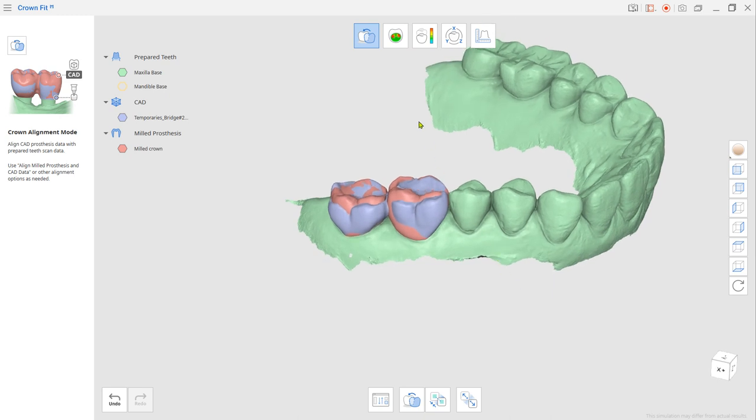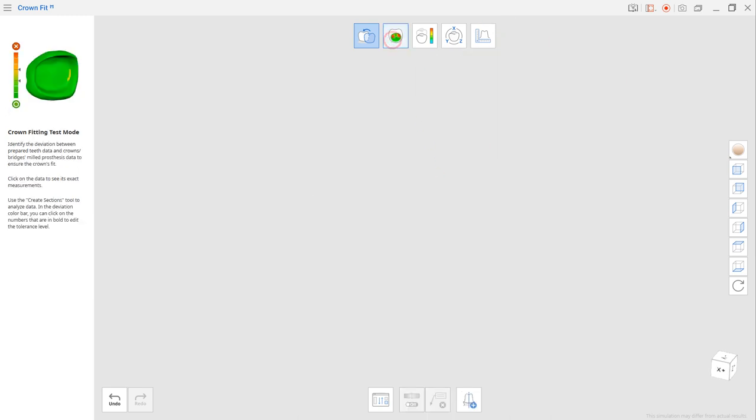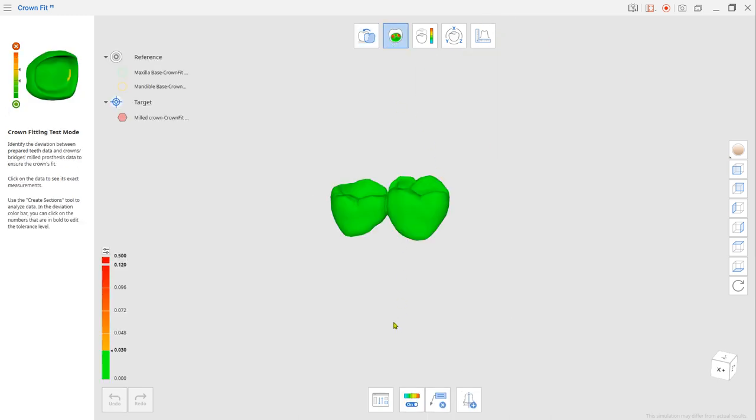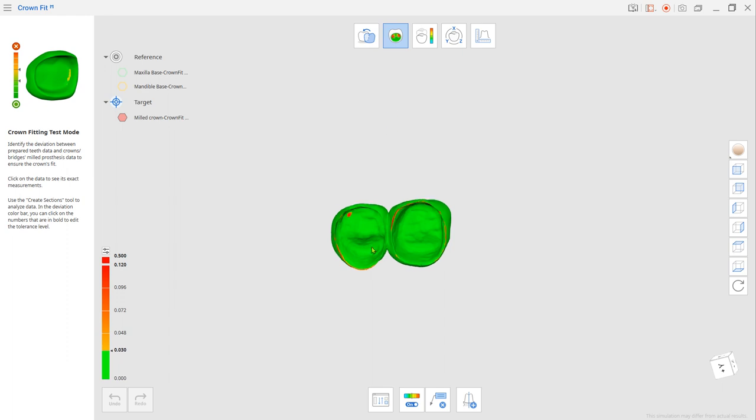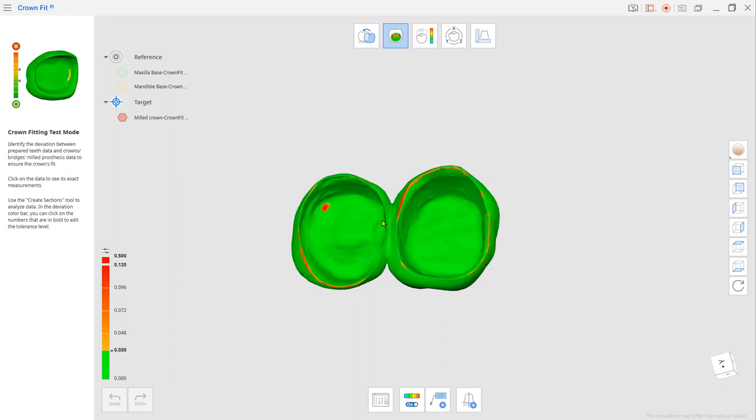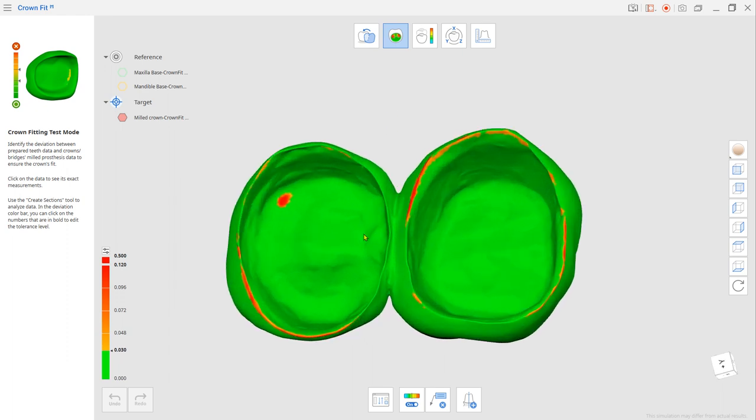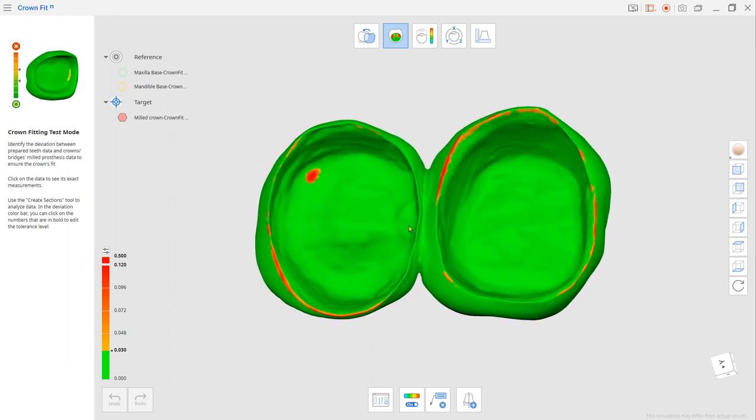Go to crown fitting test mode from the top. Click the protruded spot for the thickness measurement.